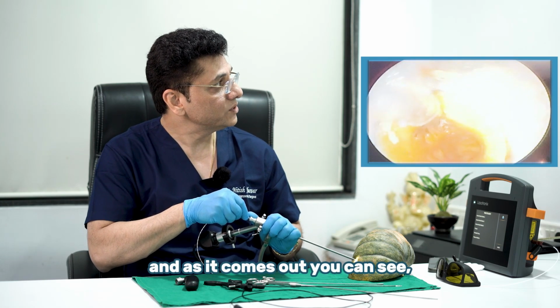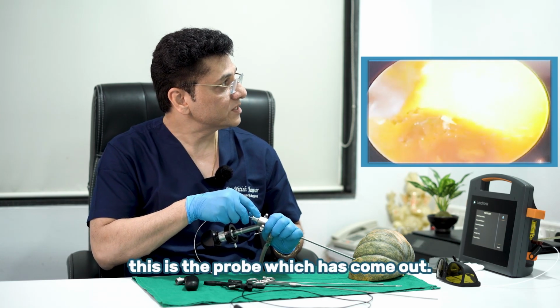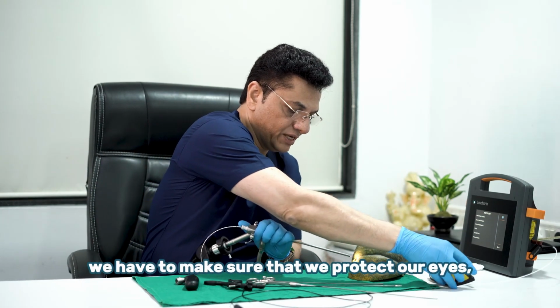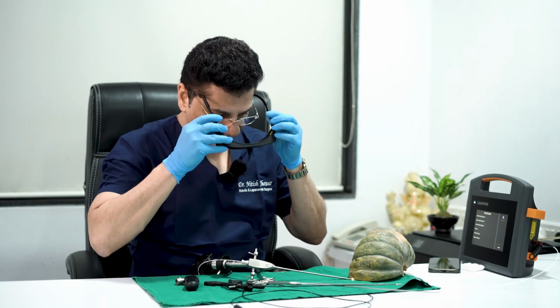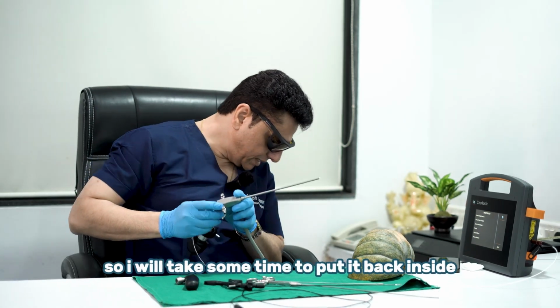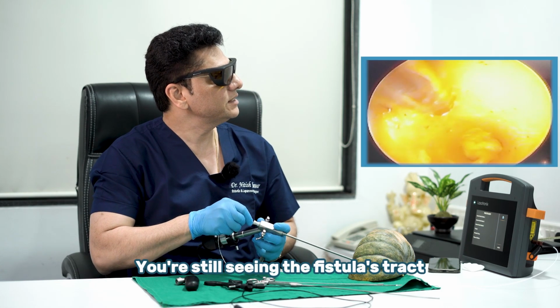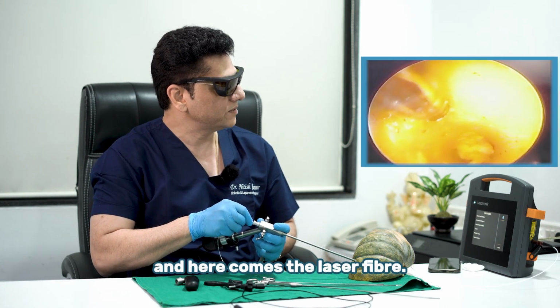And as it comes out, you can see this is the probe which has come out. Once we start firing the energy, we have to make sure that we protect our eyes. And so I'll take some time to put it back inside, and this is how it goes. You're still seeing the fistulous tract, and here comes the laser fiber.